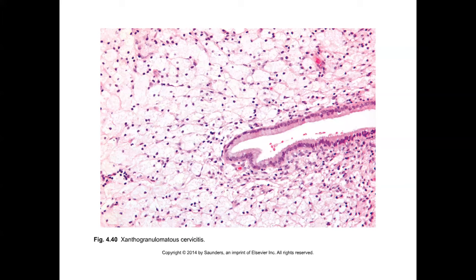When the inflammatory pattern is more histiocytic and foamy, we use the term xanthogranulomatous cervicitis. These are xanthoma cells indicating lipid material within the cytoplasm. This may be related to lipid metabolism disorders or exposure to a lipid-rich reagent, herbal remedy, or similar, but should not be confused with clear cell carcinomas, signet ring cell carcinomas, or those sorts of entities.